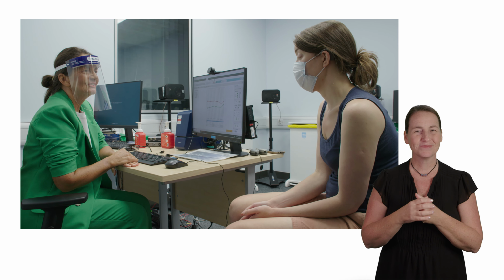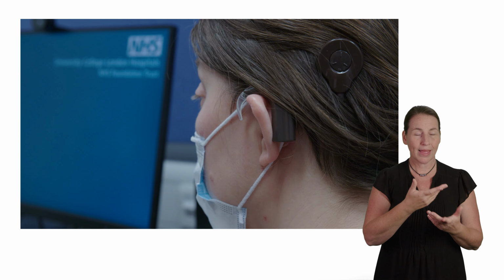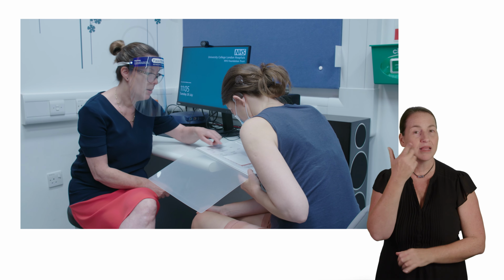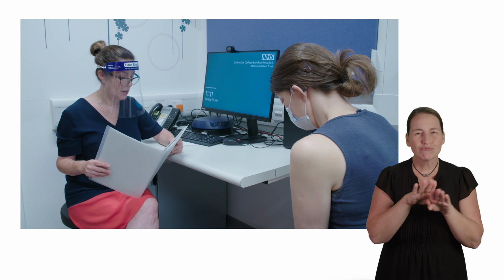Right. So for you, it might be a really wonderful experience on switch on 1, but for another person, it might take up to switch on 2 or switch on 3 before they start to feel really comfortable and at home with the device. Just repeat back what you hear. Tea. Hot chocolate. You do have to work at it a bit. But I think we guide you along the way, where we give you ideas to do at home, do on your computer, your phone, with family, with friends, so that you are able to practice.